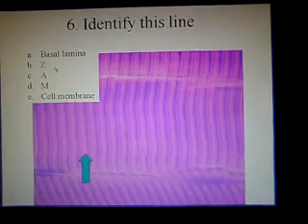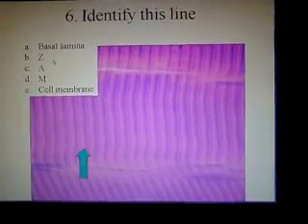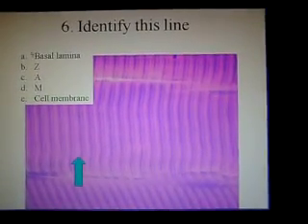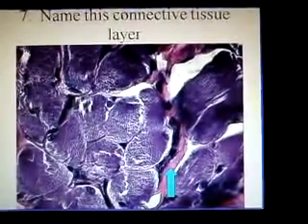is on the myofibril, it's actually a disc. So that's why some people use that term. Don't get it confused, it means the same thing. So this is the Z line or Z disc. All right, now this is stained with Verhoeff's hematoxylin.